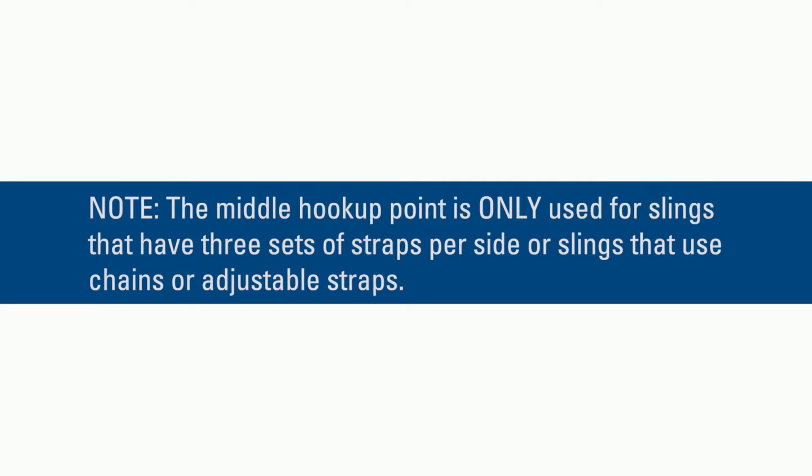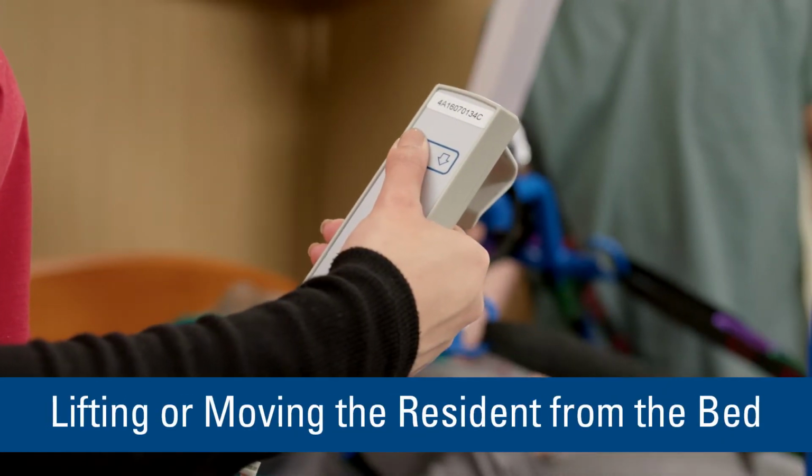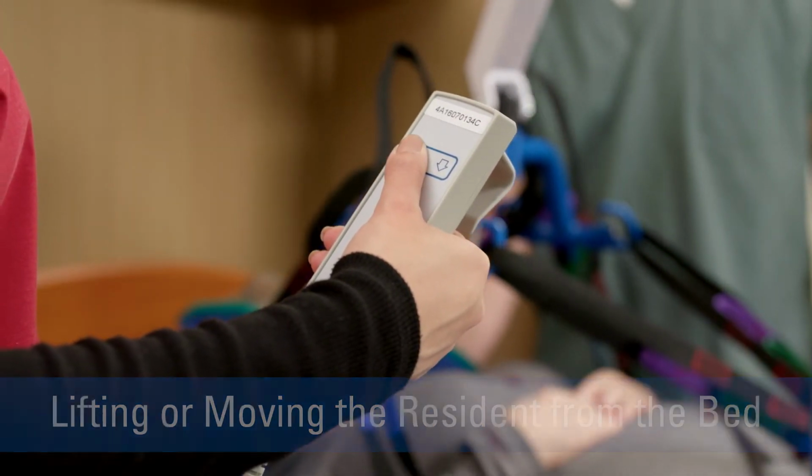Shorter straps are positioned toward the resident's back for upper trunk and head support, so he or she can be lifted in a more upright position. Colored straps make it easy to connect both sides of the sling equally. Always ensure there is sufficient head support when lifting a resident. Press the up arrow on the hand pendant to raise the resident just high enough to clear the bed.